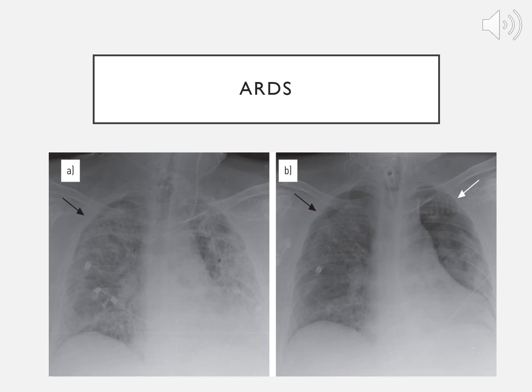You must look at the cause. So if you have pulmonary edema on a chest X-ray, normally it's congestive heart failure. Clinically, we correlate clinically. We take a good history, a good exam. We look at the reasons why this patient may have pulmonary edema. They may have an elevated BNP to help support that, and maybe even an echo, and we can say, well, this person has cardiogenic pulmonary edema. They have congestive heart failure.